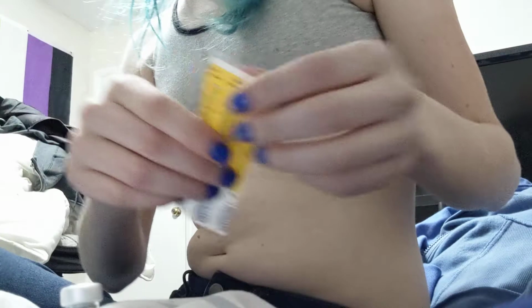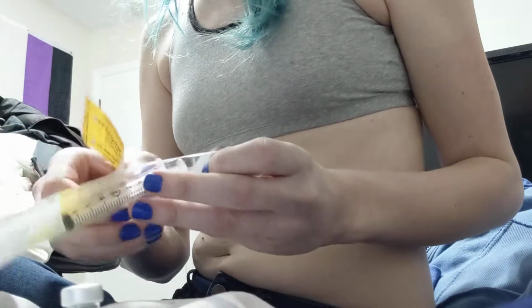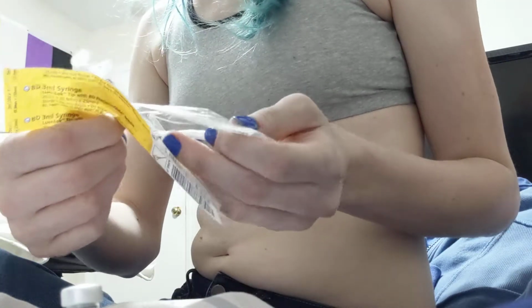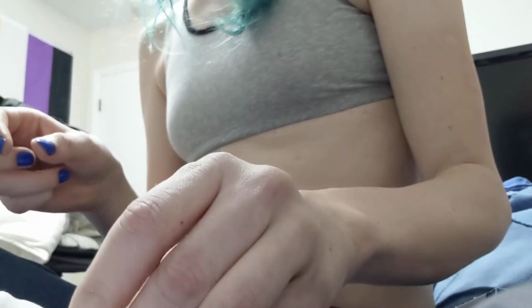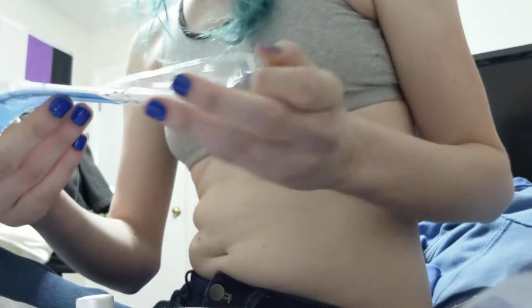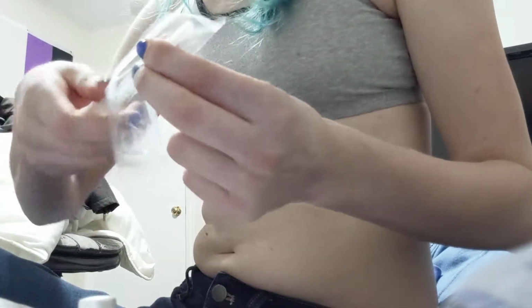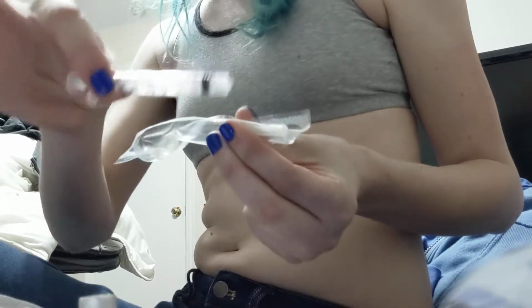I'm going to take the first syringe, which is the one that's a larger syringe with a larger needle. Put it like this, plastic side down. Make sure the needle nor the syringe touches anything until you're ready. I'm going to take the 1 milliliter syringe with this smaller needle on it. Make sure not to touch any part of the needle. So I want to grab the actual syringe, but don't touch the actual casing around the needle. Twist it off. Take this larger syringe and chuck it.